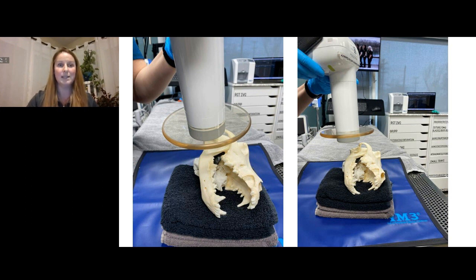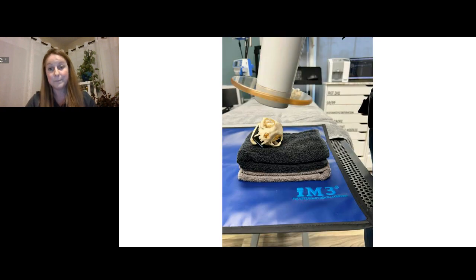And on here, you can see if you're coming from the front of your patient or towards the nose here, if you're coming from this angle and you're trying to get those teeth on that rad and you're still struggling, try switching to this. Try coming from behind just a little bit, and that's going to allow you to cast the shadow from the teeth in the far, far back just a little bit more onto your plate there.